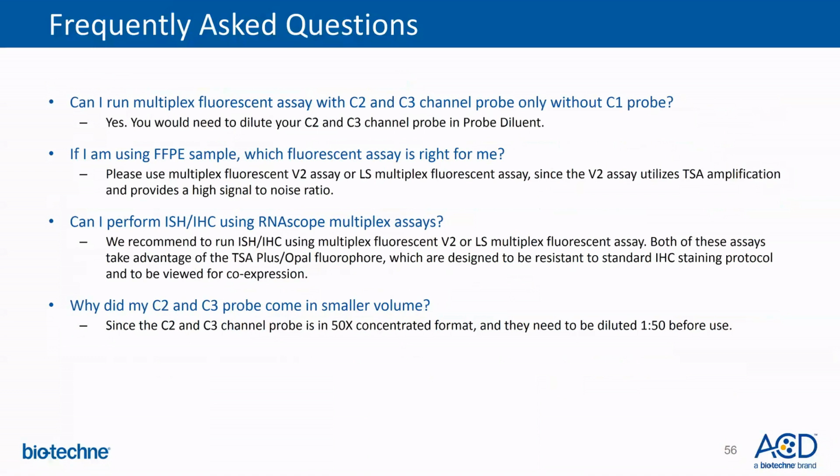Why did my C2 and C3 probes come in a smaller volume? As I mentioned earlier, C2 and C3 channel probes are in 50x concentrated format and should be diluted 1:50 before use.